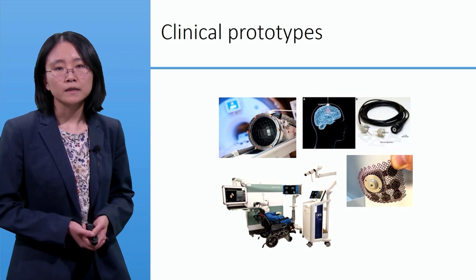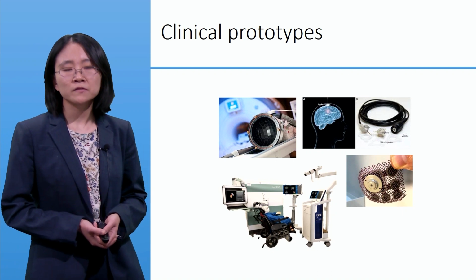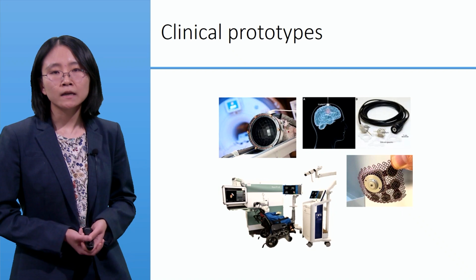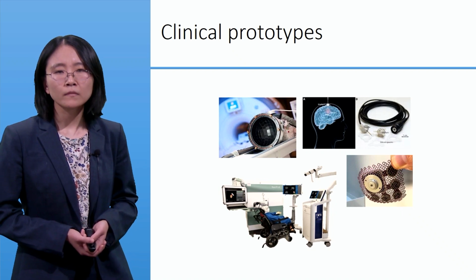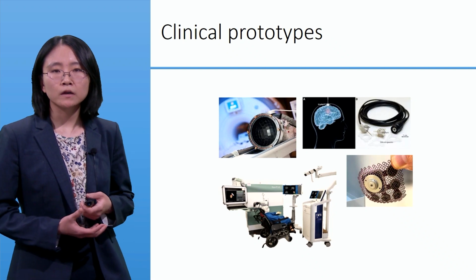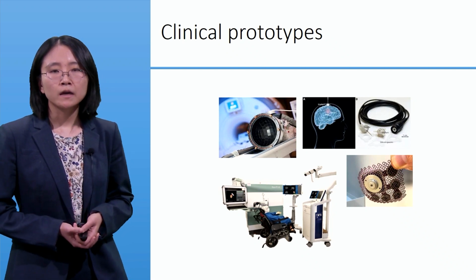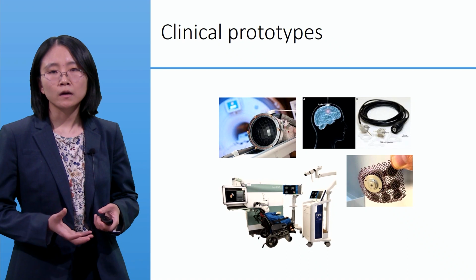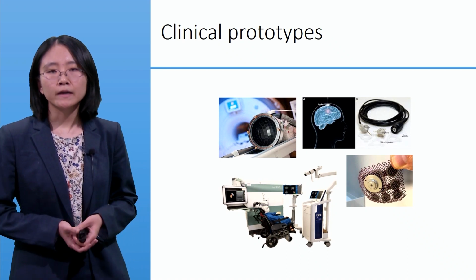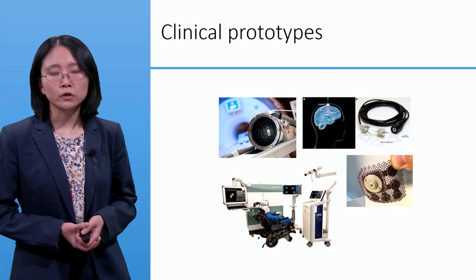On the top left is an example of a hemispheric array that is coupled to an MRI. The MRI allows the operator to direct the target in real time, select and contour the ultrasound beam to the exact volume and shape that we would like the drug delivery to occur.